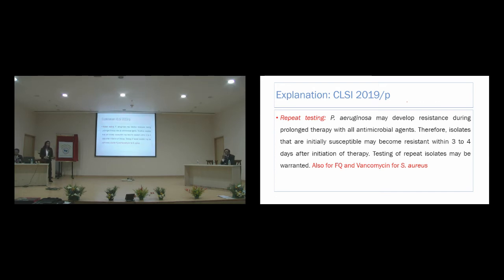I was expecting that somebody will raise that topic. Why don't we use nalidixic acid resistance as a surrogate marker for fluoroquinolone resistance anymore? Is nalidixic acid resistance a surrogate marker of fluoroquinolone resistance? No. Nalidixic acid susceptibility is a surrogate marker of fluoroquinolone susceptibility. Nalidixic acid resistance actually tells us to go for MIC testing. So the predictive value of nalidixic acid is so poor that it has been removed.